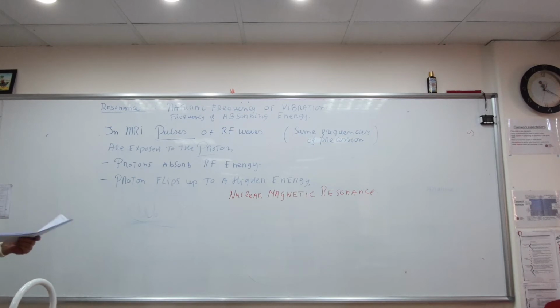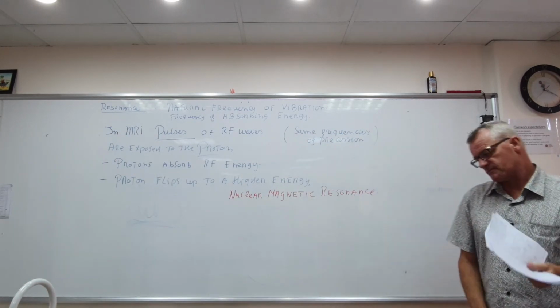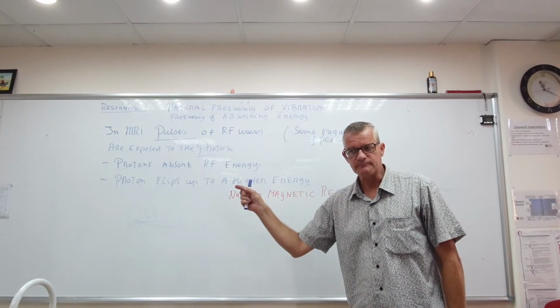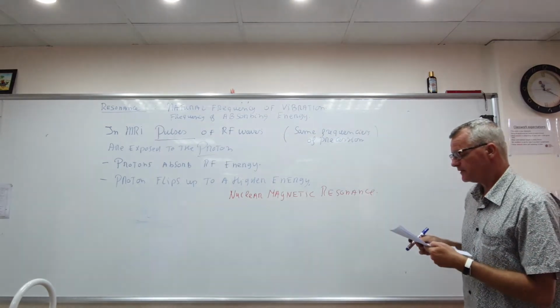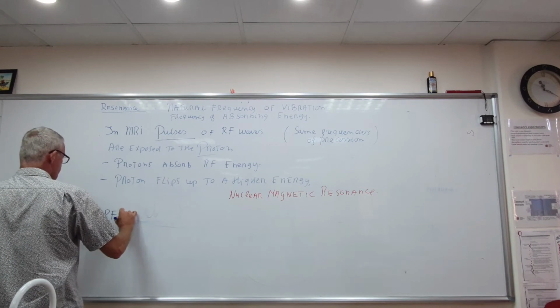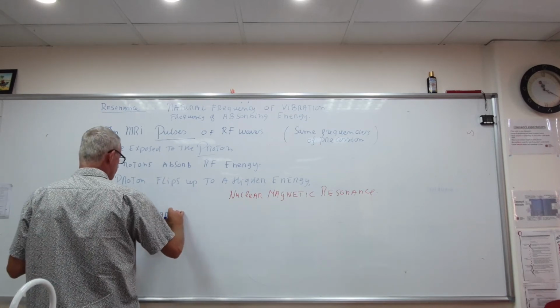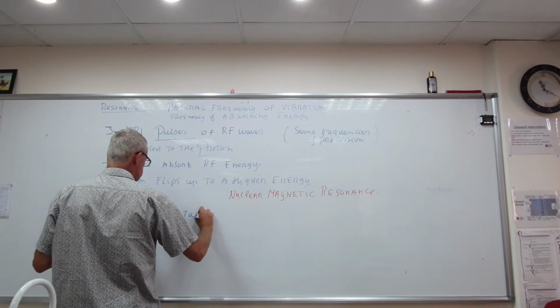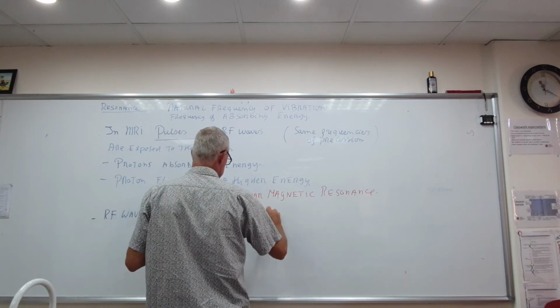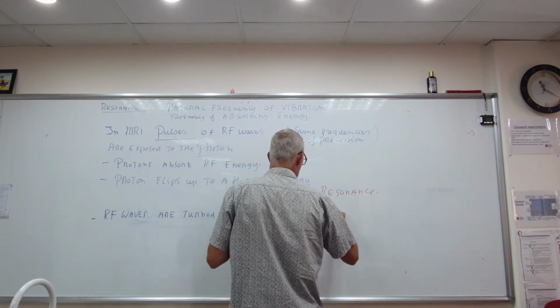Now, I told you that we are going to give pulses to the proton. That means it's like we're switching it on and then we turn it off. So, RF waves are turned on and then switched off.